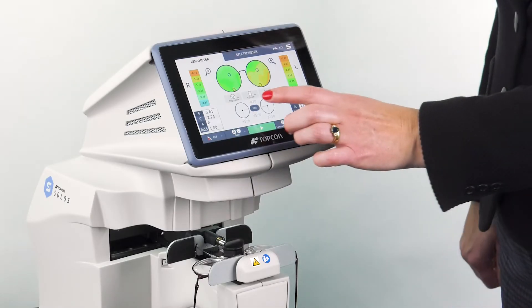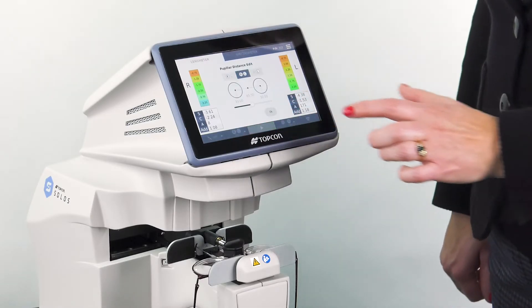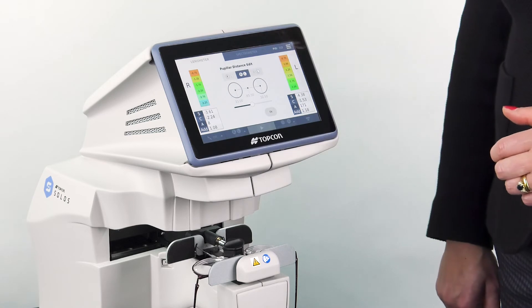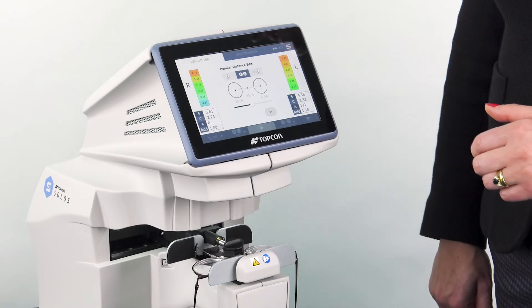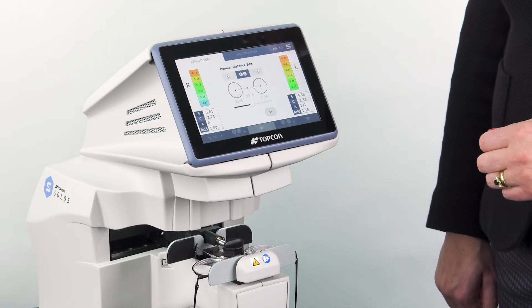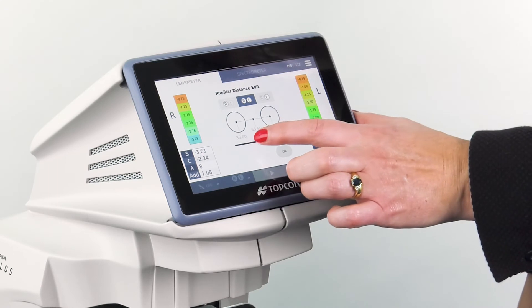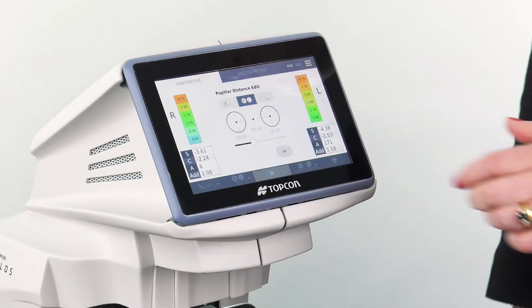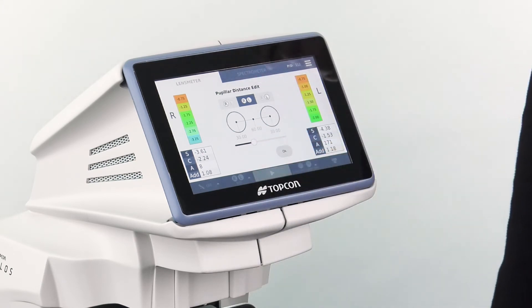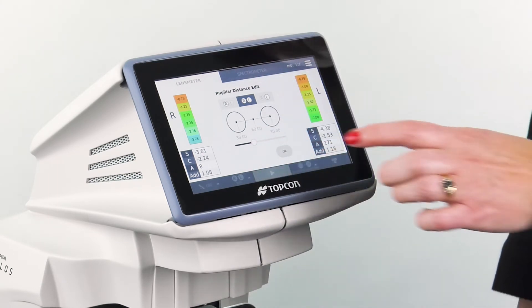If I select to edit, I can add in the pupillary distance, which then allows the Solos to provide information about the amount of prism that would be induced for a particular PD value.